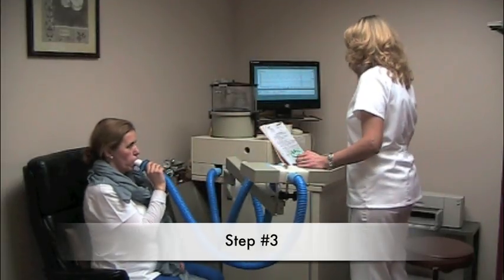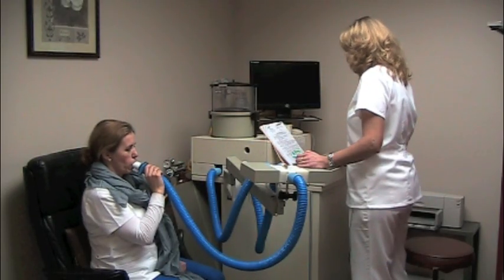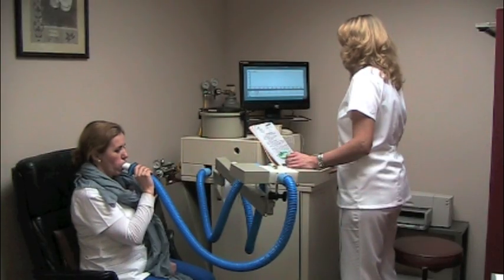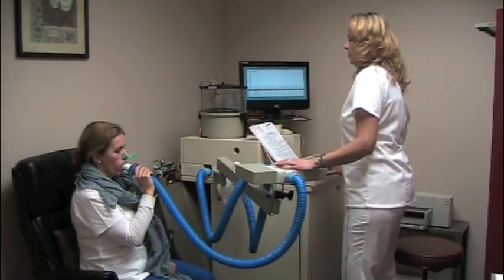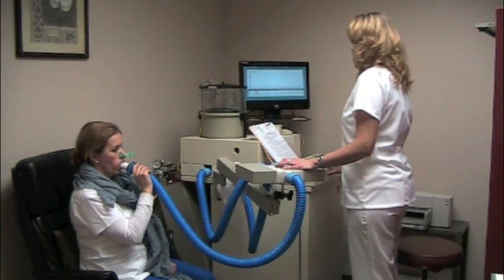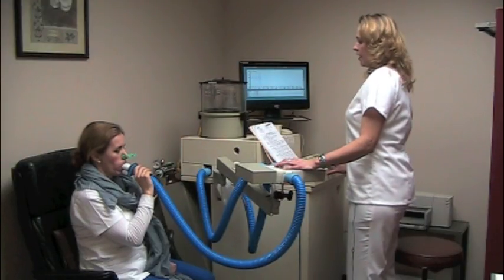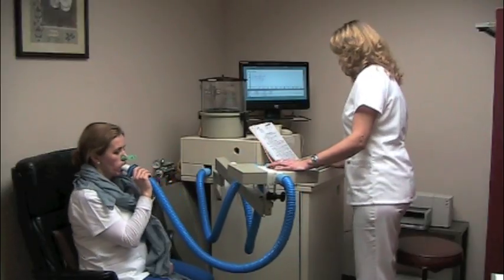Now we're ready for step number three. I ask you to breathe normal. Breathe normal. In and out. Take a deep breath in and blow it out. Very good. Thank you.